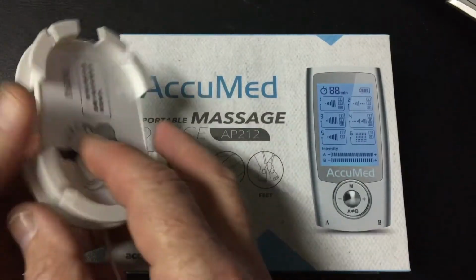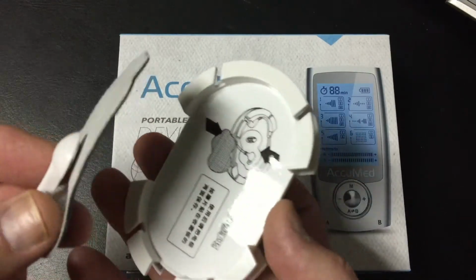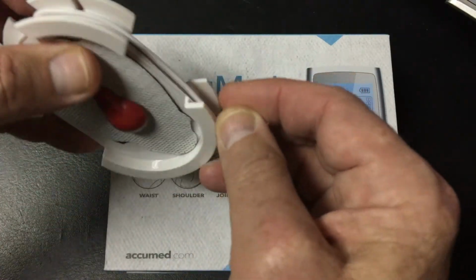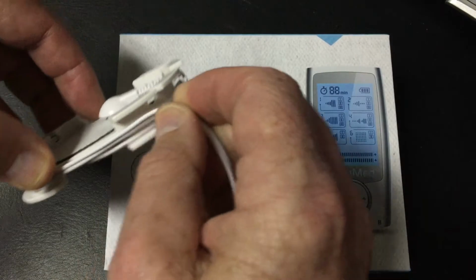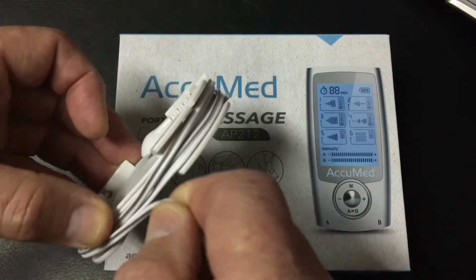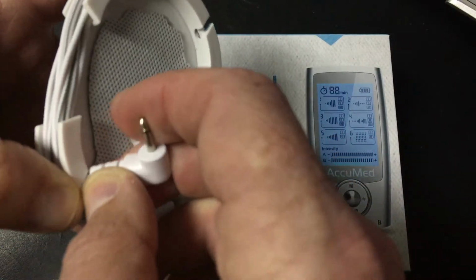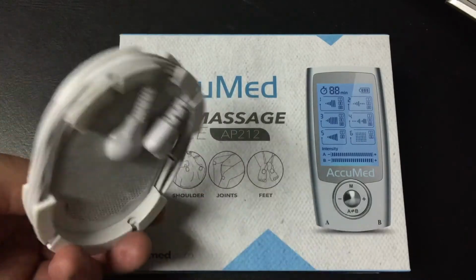Now when you're finished, to store this, it's pretty simple. Just pull your electrodes off and stick them on this device, the cutout at the bottom for your wires, and then you can simply wrap the electrode wires around. It's really cool that they gave you a device like this. You can order extras of these if you like, but one will do for me anyway. When you get to the end, simply tuck it around like that, place it into this groove, and it's set for storage.